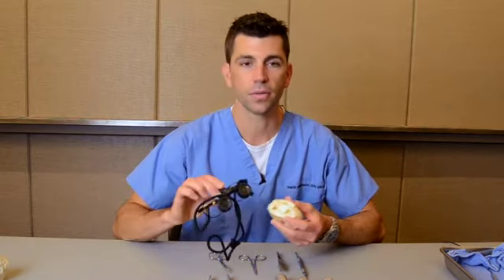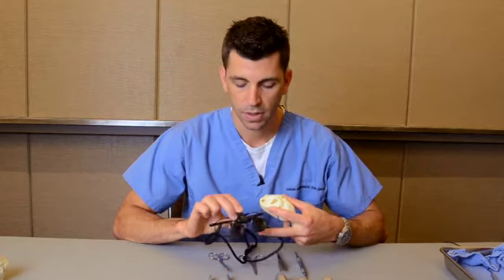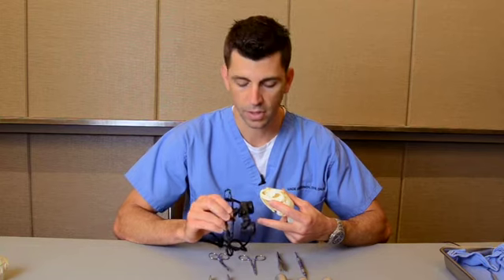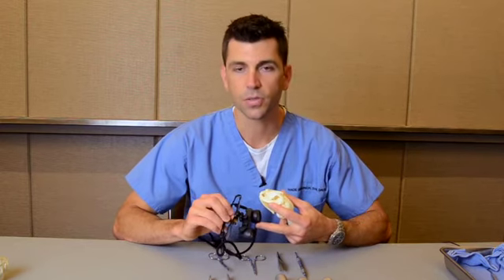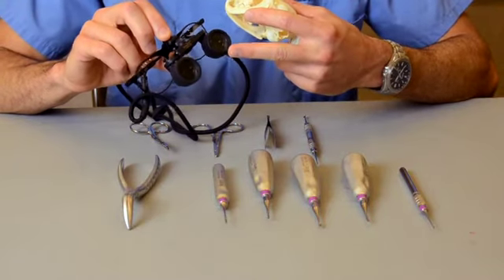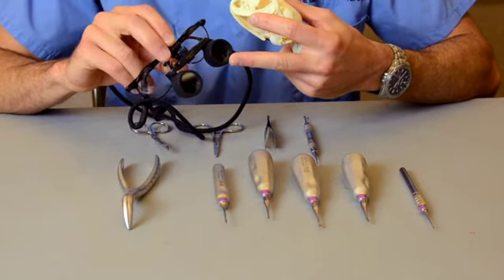Because I consider feline dental extractions to be a microsurgery, magnifying loupes can be an extremely helpful tool. What this is going to allow you to do is see some of the microanatomy that you're going to encounter during dental extractions in cats. You can find these through any distributor. They are fairly affordable, and they'll pay for themselves when you find that it's going to make you more efficient in your surgical procedures, and it's going to reduce some of the chances of complications. So I feel that every surgeon that's performing feline dental extractions should have a good pair of magnifying loupes.